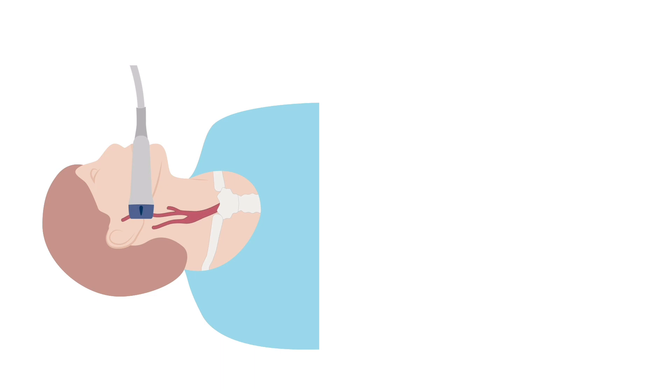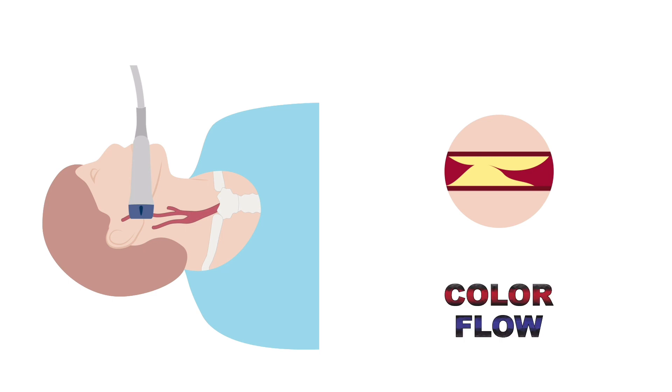In some cases, such as when there is extensive disease or heavy calcification, switching on the colour flow may help to identify the vessels and the presence of disease.